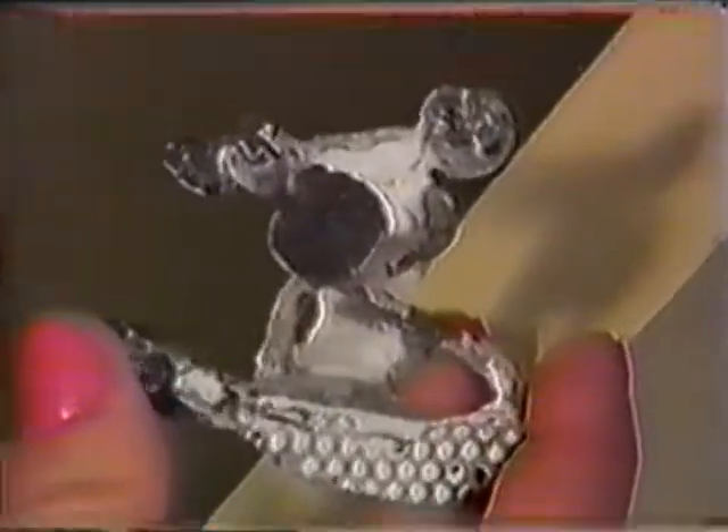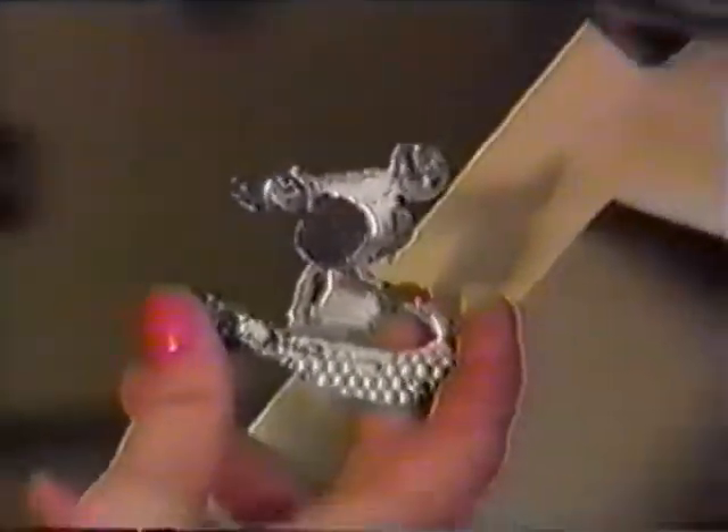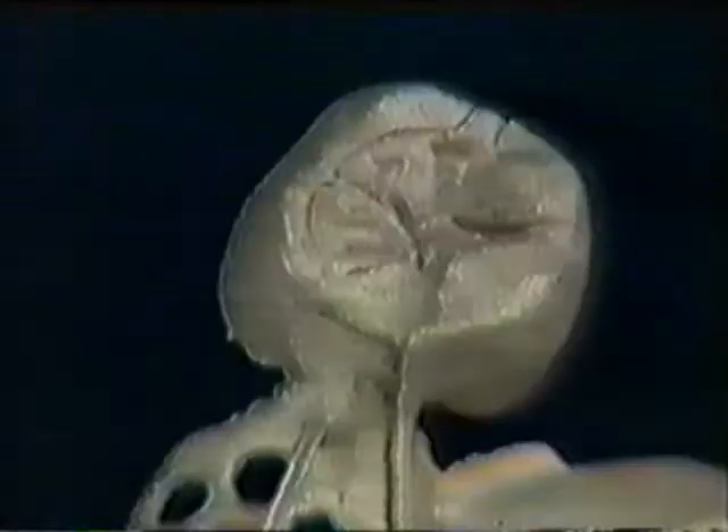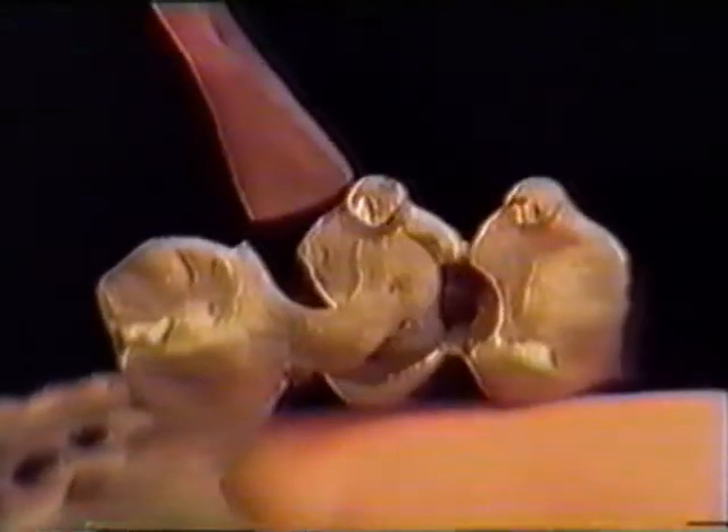After the muffle has cooled off, carefully deflask and sandblast the structure to remove all investment powder residues. Don't separate the primary and secondary parts before sandblasting is complete. Observe the exact fit of the cast-on parts. Use a riveting hammer or a compressed air deflasking unit to separate the primary and secondary parts by carefully tapping on the sprue stumps of the crowns.